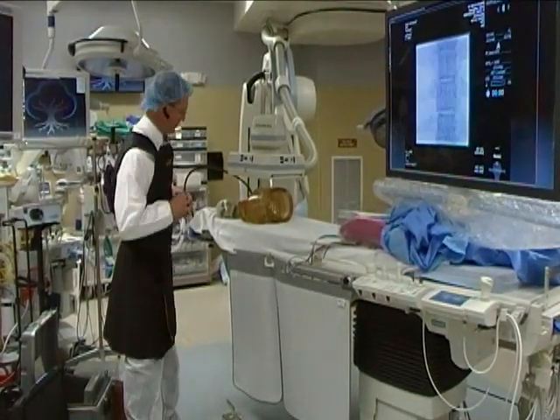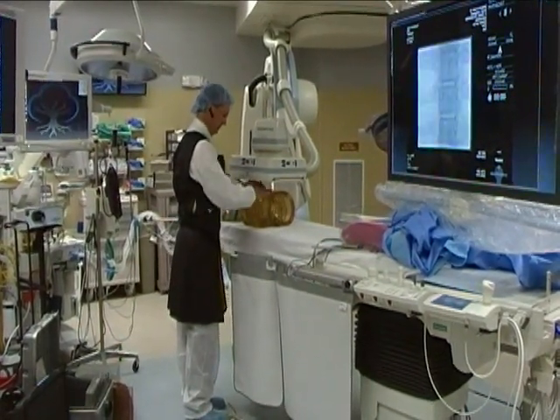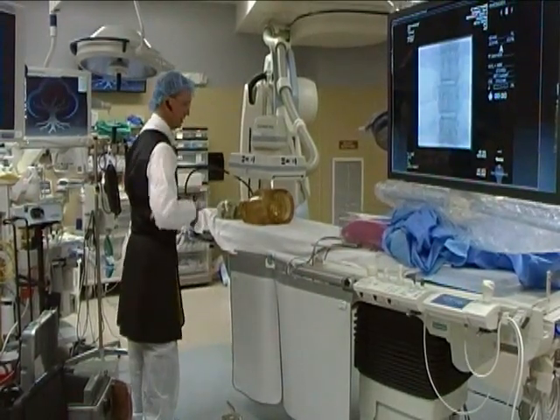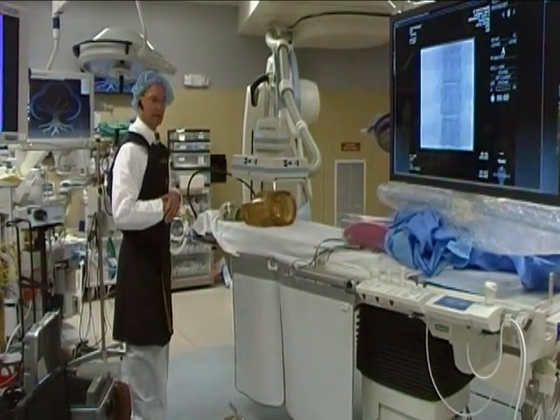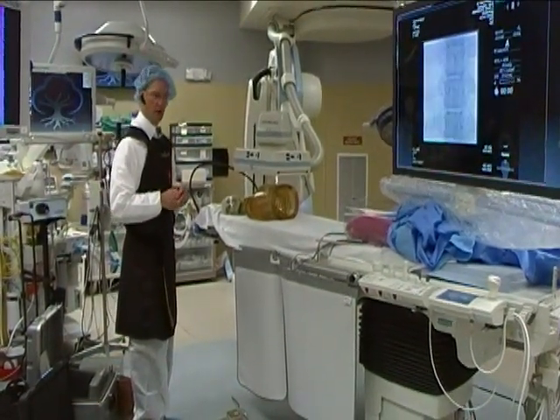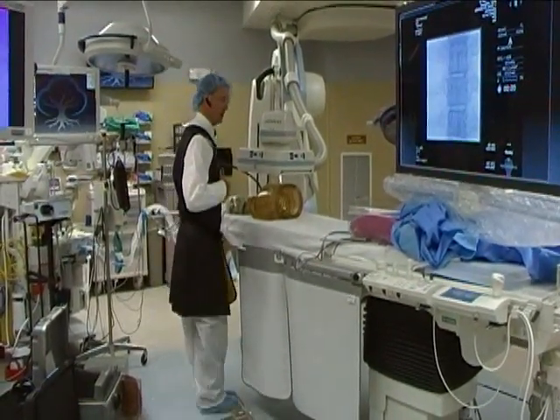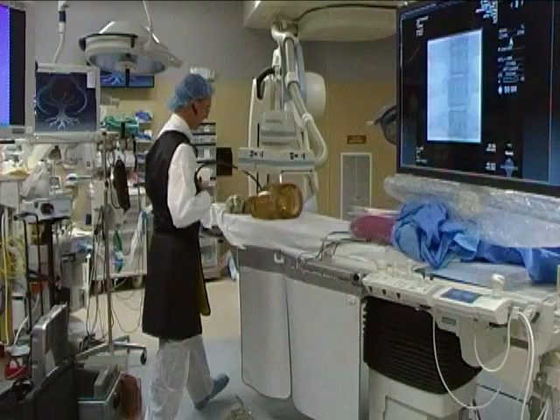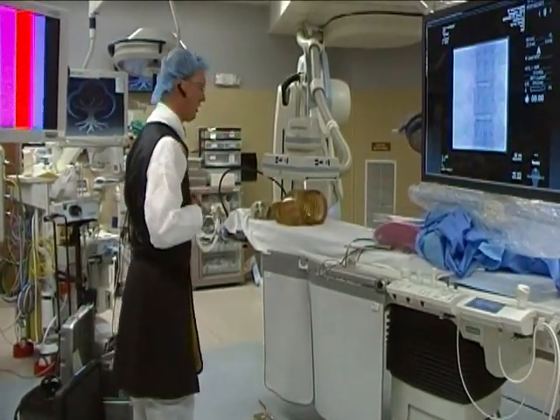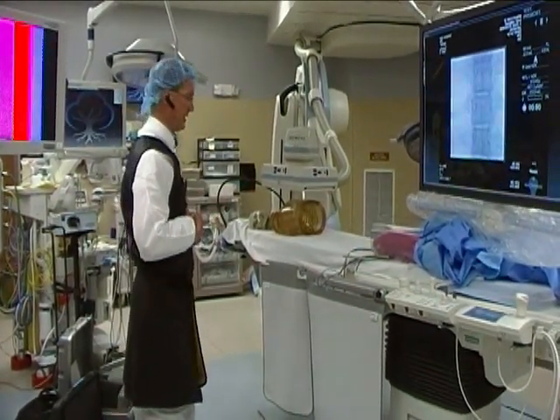Distance is another thing that's very powerful. If I'm standing right here at half an arm's length away from the patient, if I move back an arm's length, I've now doubled my distance, but due to the inverse square law, I've reduced my exposure by a factor of 4. So it's a fourth of the radiation here as opposed to here. And again, if I go from here to here to here, I'm down about a tenth of the radiation I got up there as the belly up to the patient.